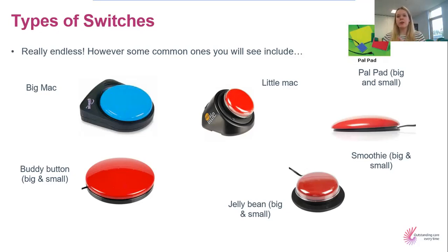But the thing is, because they're flush with the table and they don't click, they wouldn't necessarily be good for someone with, say, a visual impairment who would have to know through a clicking sound that they've activated that switch.